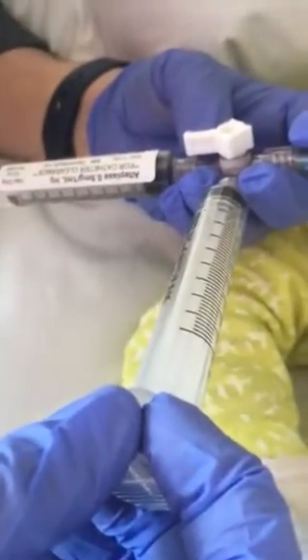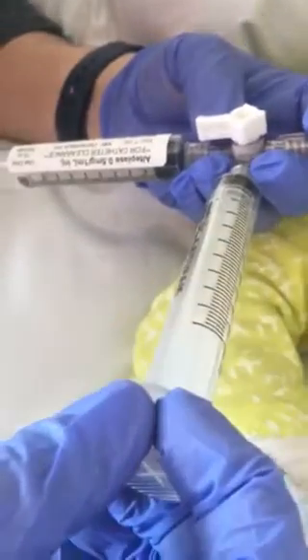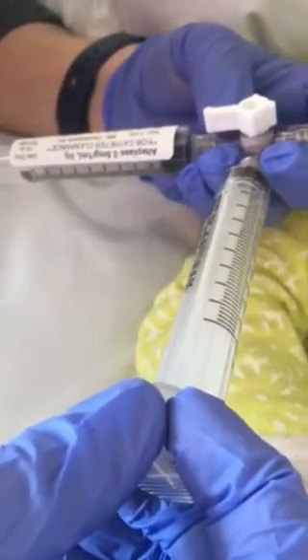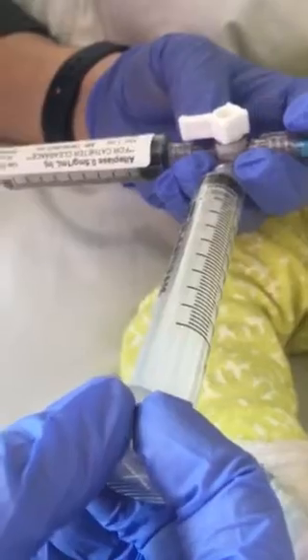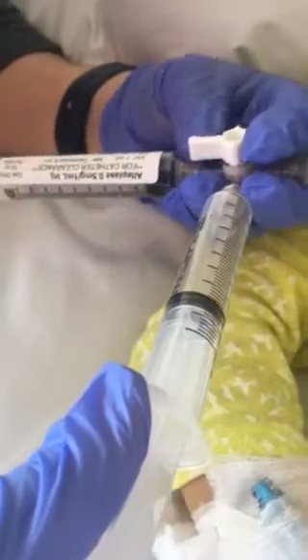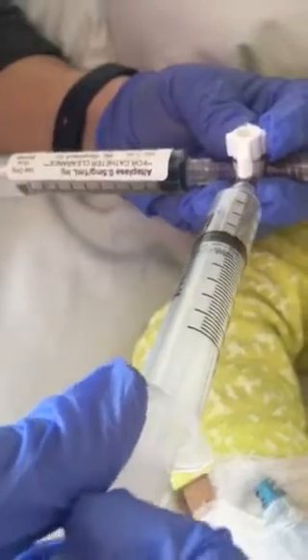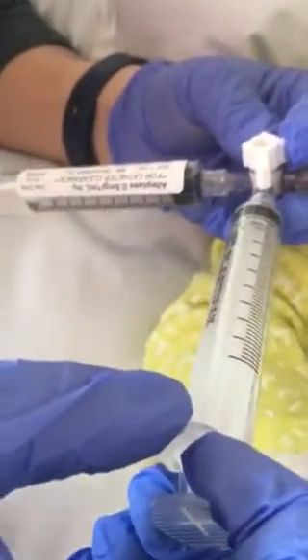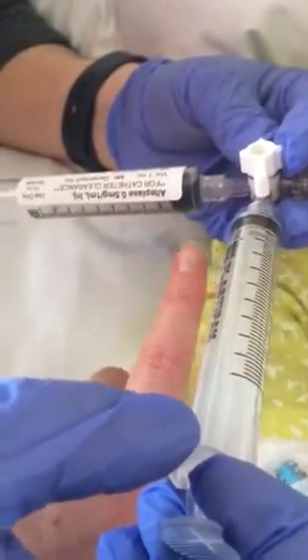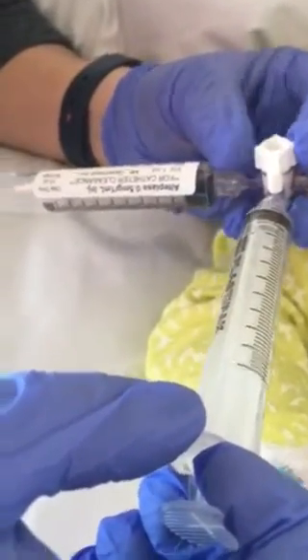We have a totally occluded catheter. We have our TPA on one syringe and our empty 10cc syringe here. First, we're going to aspirate on the empty syringe back to the 7 to 9cc mark, turn the lever off towards that syringe, and let the plunger go. The hope is that a small amount of the TPA in this syringe gets sucked into the catheter, so we'll keep repeating that same motion.